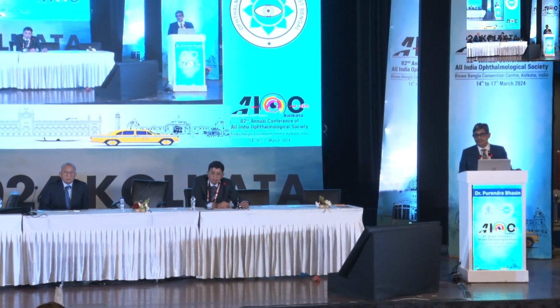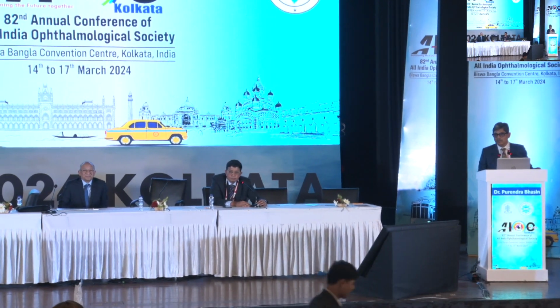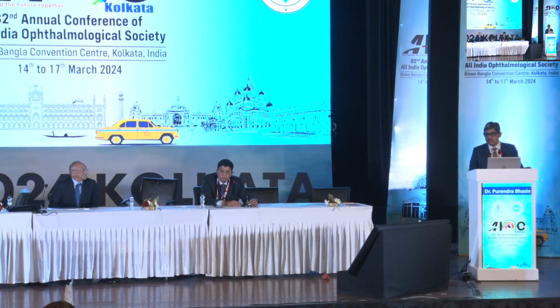For those cases where the ACD is extremely borderline, like you may get 2.77 or 2.78, you're in a dilemma because the patient is not a candidate for LASIK. So can you do some adjustment in your ICL parameters and/or do a PI, although we are not doing PI these days? Is there any way to circumvent this?